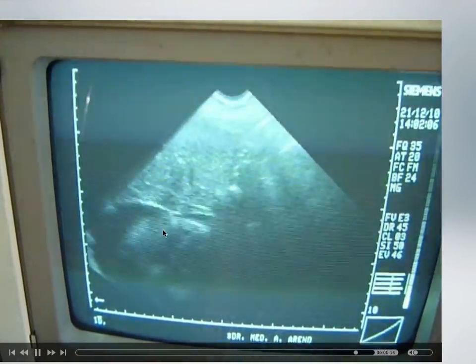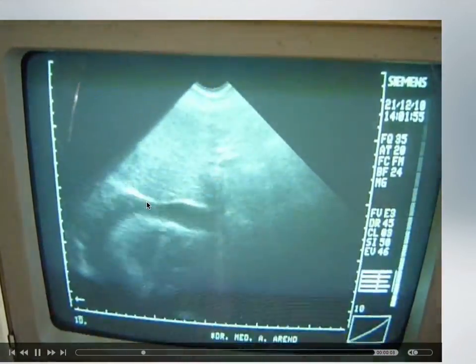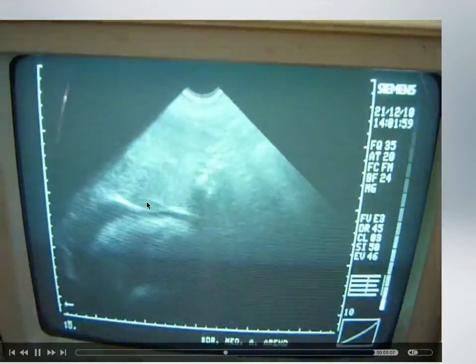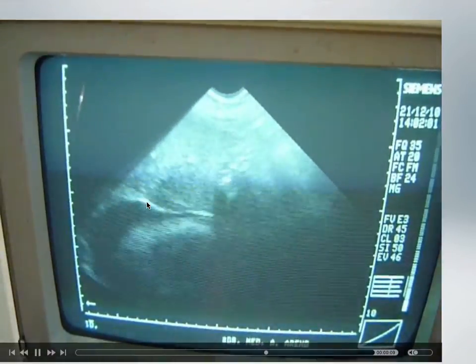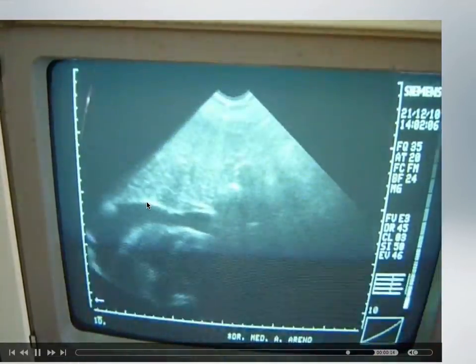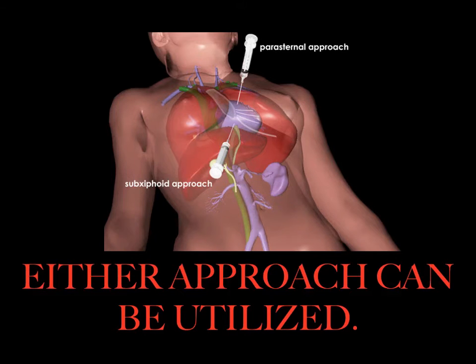And you can see some diastolic collapses. The heart is swinging back and forth inside this large effusion. So this patient's shortness of breath was more than likely not due to her asthma being kicked up by the harmattan or the sands, but it was due to her renal disease causing a very large pericardial effusion and tamponade.